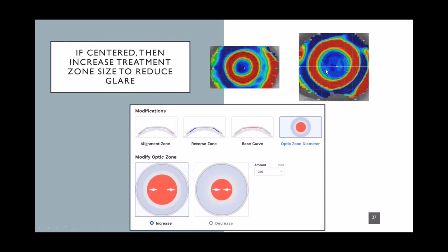here you have, if you increase it, just an example of how it gets all the way outside of that black pupillary zone. And so this is more like Ortho-K for an adult. For kids, or when you really need myopia control, you need at least part of that peripheral power ring to be within their pupillary zone.